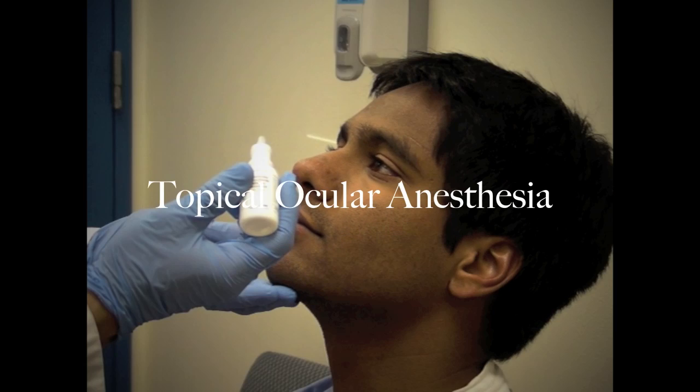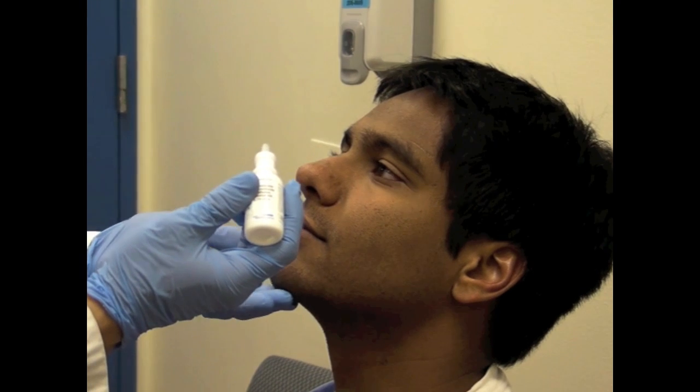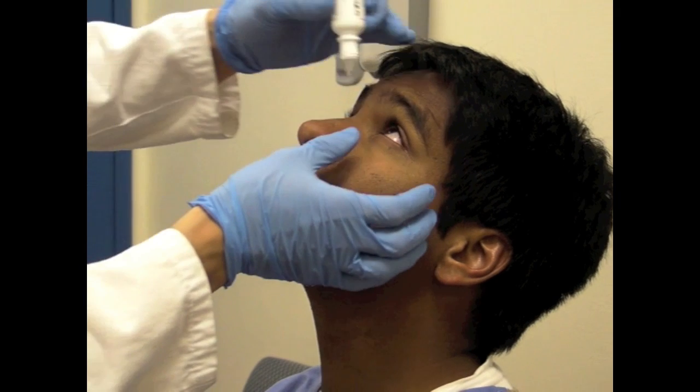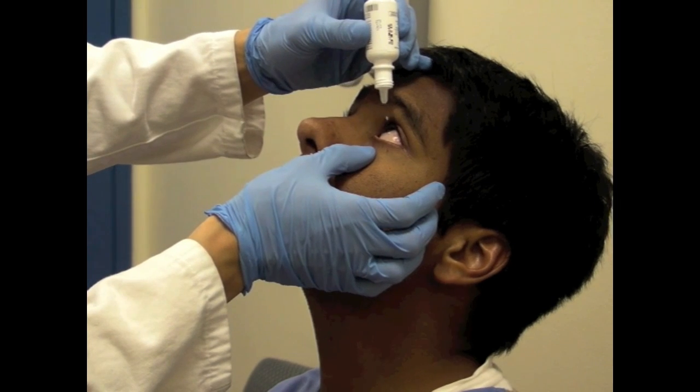Before using the tonometer, it is important to anesthetize the patient's eyes with topical anesthetics. One way to administer drops into the eyes is by having the patient tilt their head back while looking up. Gently hold the lower lid while you are applying one or two drops.